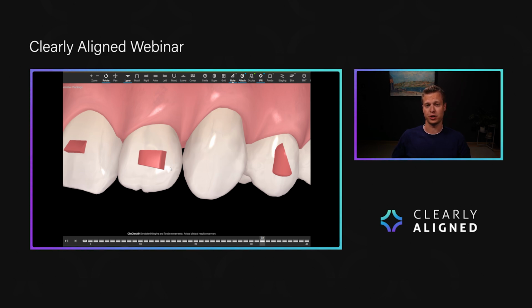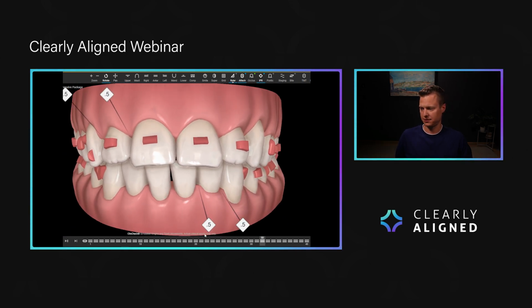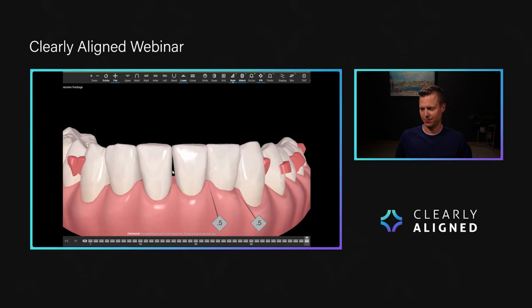A good friend, Richard Schmidt, he's been showing lots of cases where, give it 6 months and the gingiva actually will start to come down again. So I don't do as much IPR for black triangles as I used to a few years ago. Now I often do give it a chance for 6 months to see if it will get better, and then if it doesn't, we can always jump in with some IPR or some bonding. Same thing on the bottom here. As we derotate these lower incisors, you will see a black triangle here.